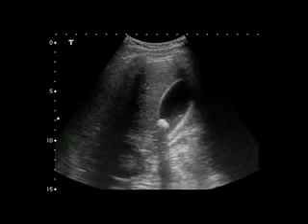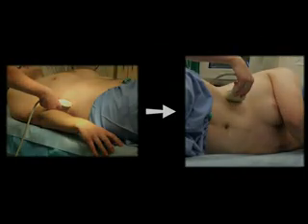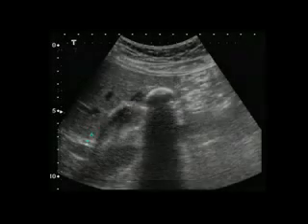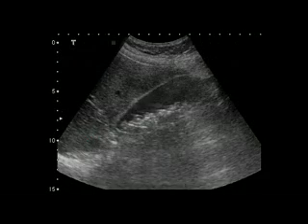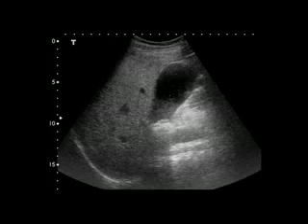Gallstones in the gallbladder generally appear as hyperechoic structures with significant shadowing. If they are not impacted in the neck of the gallbladder, having the patient change position should show free movement of the gallstones. Gallstones range in size from small to golf ball size. Smaller stones are more likely to cause symptoms by becoming obstructions. Polyps and valves of Heister may be misidentified as gallstones. Gallstones that are impacted in the neck may be missed.